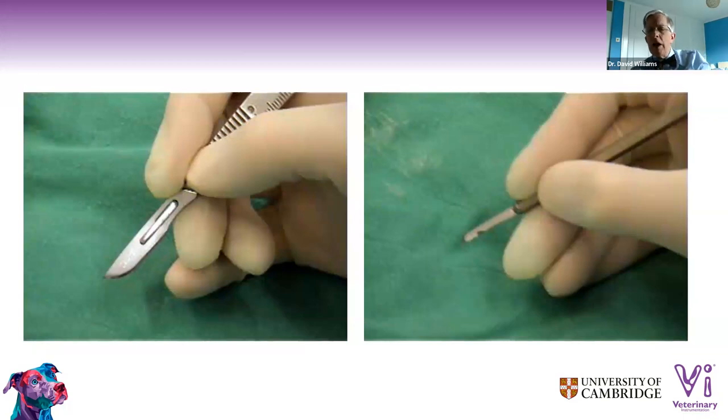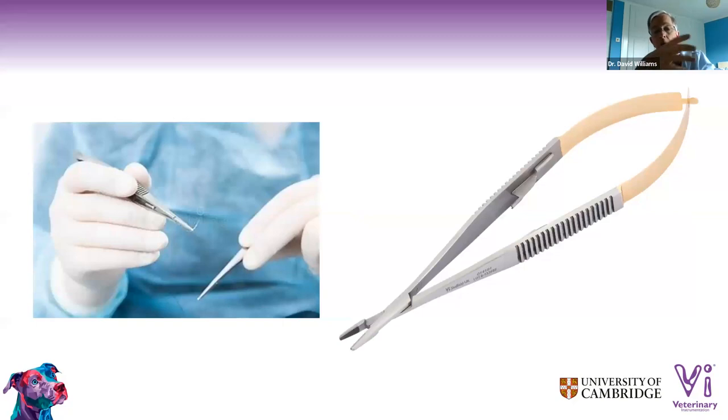So back to blades, in the Veterinary Instrumentation kit, there's a Beaver blade, which is the blade that you'll see on the right hand side there. And some people say, oh, can't I just use a Bard-Parker? Well, the lovely thing about the Beaver blade is it's so small and it's got such a fine handle that actually the blade becomes part of the end of your finger, and is much easier to manipulate than a larger blade. If you haven't got the smaller blade, it's not the end of the world. You can certainly, with a number 15 blade, which is a larger blade, do the majority of stuff, but the Beaver blade really allows you to be a bit more delicate in your cutting.